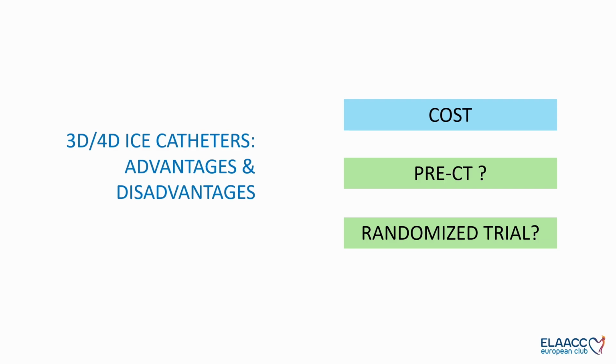Limitations: I think the title of your talk, Sergio, was advantages, but I didn't see any disadvantages. Probably cost is something that we have already discussed, and we can also consider whether, if we have this kind of images, we still need pre-CT, something that we have discussed. And of course, we always ask for data. I don't know if it's worth having a randomized trial on mini micro TEE probe versus ICE 3D, 4D probes.